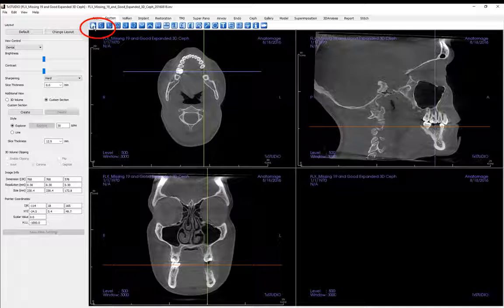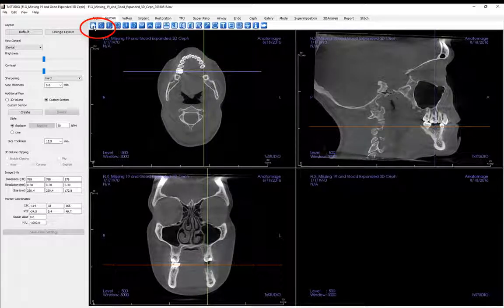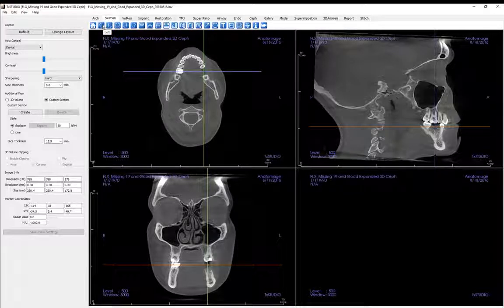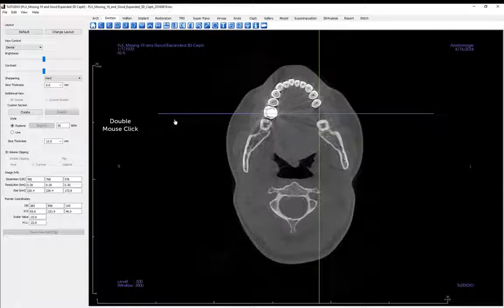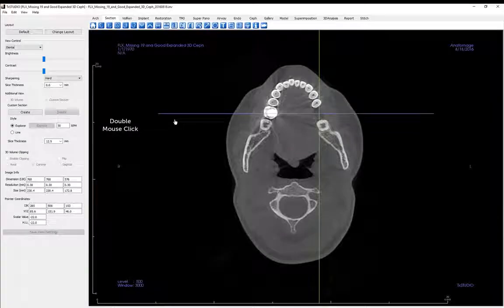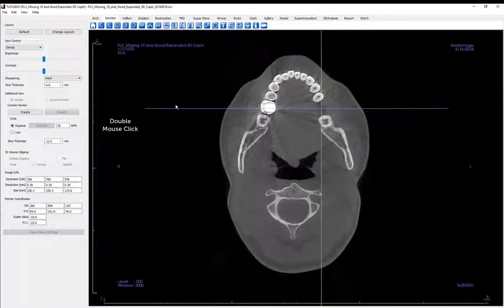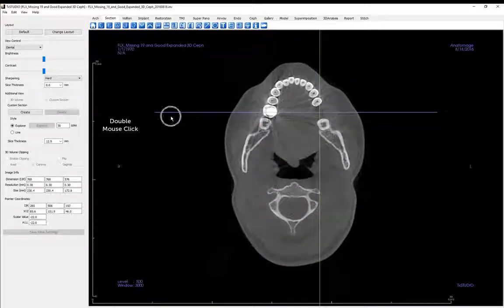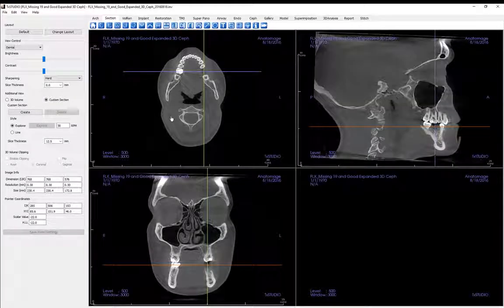You will see that a description of the toolbar icons will appear if you hover over them with your mouse pointer. The second way to increase the size of the image is to double mouse click on it. Use the aforementioned directions to zoom in and zoom out further. To return to the original view, double mouse click on the image again.